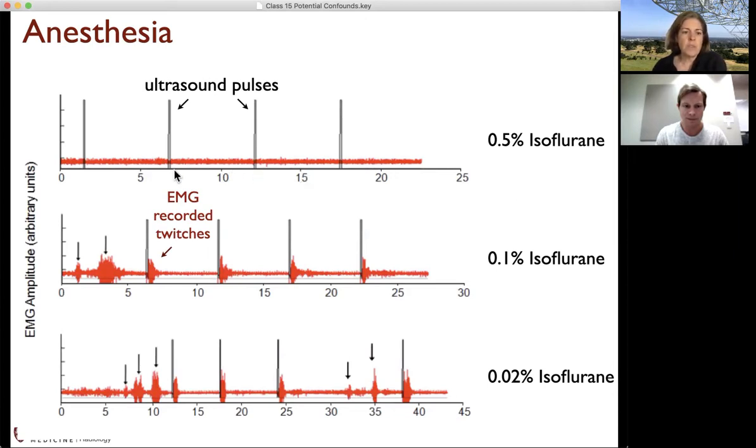What we found, these were the ultrasound pulses, and then we were looking to see the EMG response. And we did this at 3 different levels of isoflurane. So 0.5% isoflurane, which is itself low, because usually they expect you to keep your animals at about 2% isoflurane. That was a bit low to begin with, but you can see there aren't any EMG responses. And then when we lowered it to 0.1% isoflurane, you can see that there are nice responses to the ultrasound.